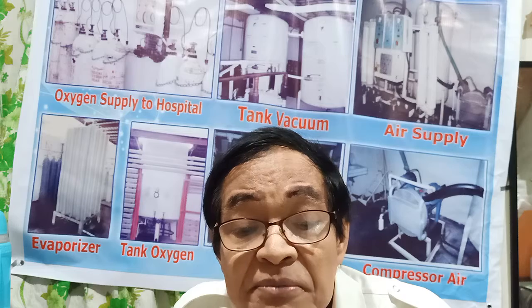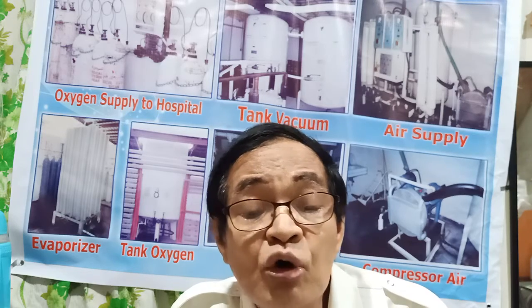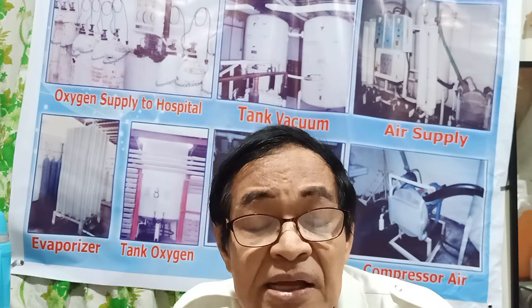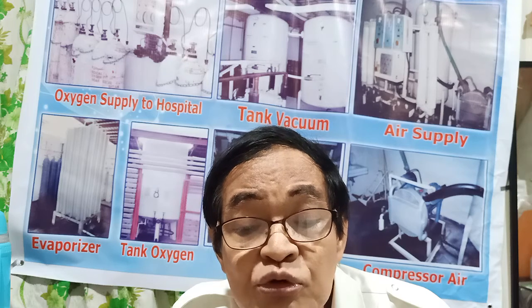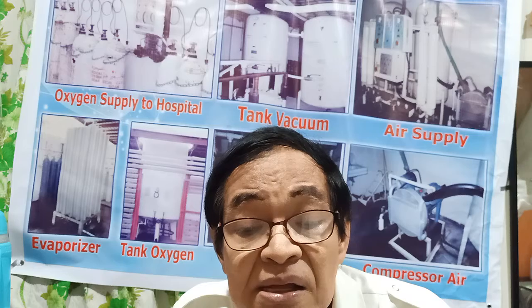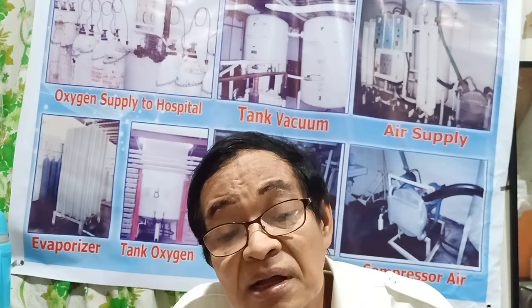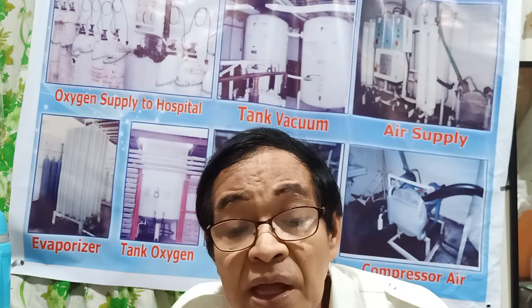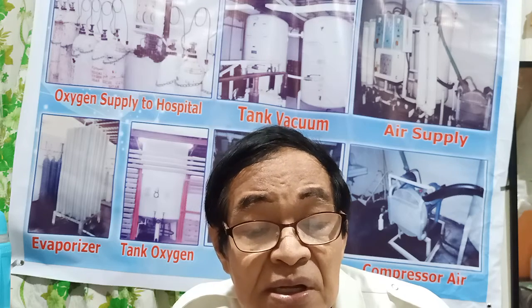Repeater alarm panels are installed in the building, for example in the plant room, with a code number for the room, and the engineering office.